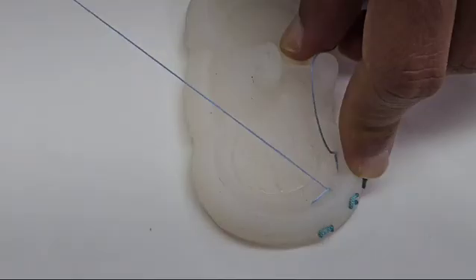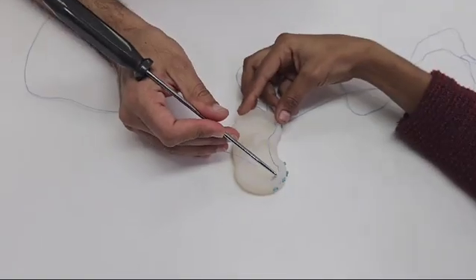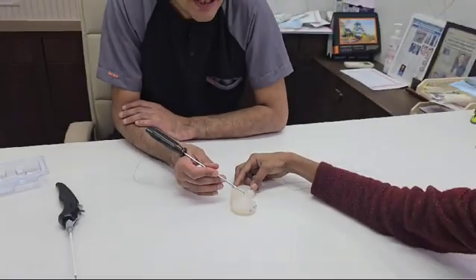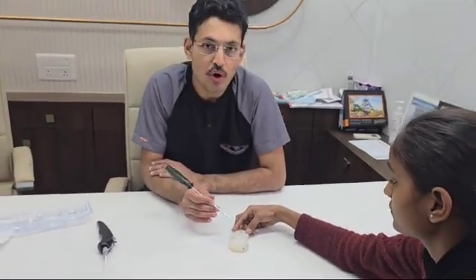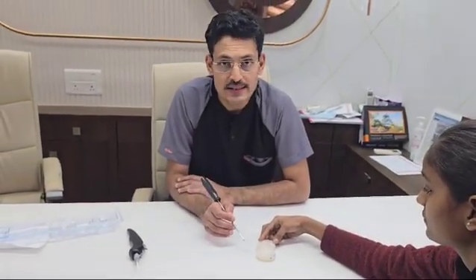This gives a very nice purchase and very nice repair after the fiber stitch repair implantation. This is one of our preferred devices for all-inside, all-suture meniscus repairs.